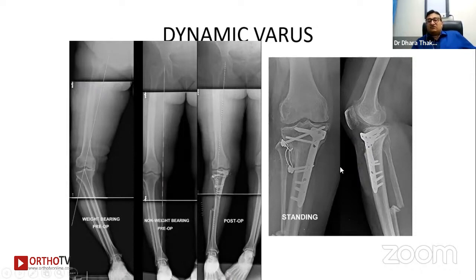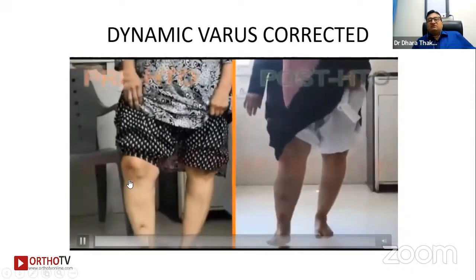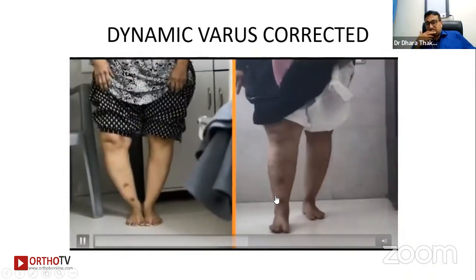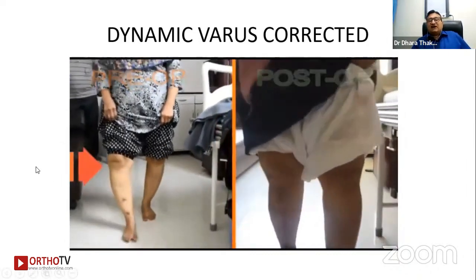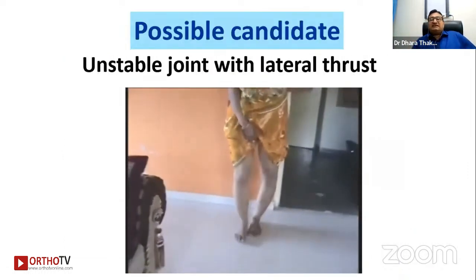And that was after 6 months, this was a weight-bearing X-ray. Now this opening was not there after this correction. And if we see after surgery, this dynamic varus has been corrected. Now, post-operatively, we can see that there is no opening of lateral joint space. So if we do proper high tibial osteotomy, even varus more than 15 degree and dynamic varus, all these things can be corrected. Here, we can see that there is a lateral thrust.